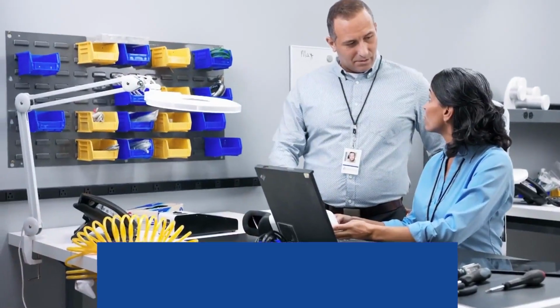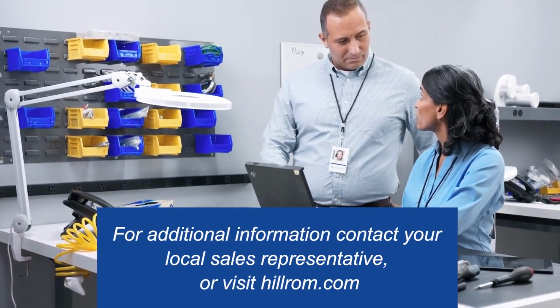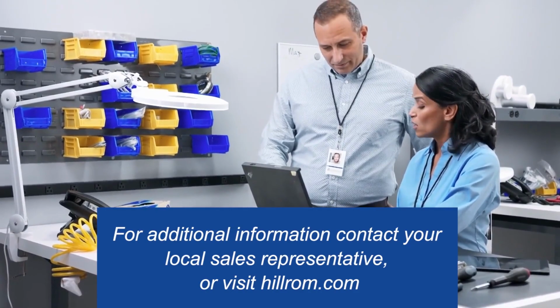This completes our overview of remote asset management, a better way to manage devices on your healthcare system network. For additional information on the platform, please contact your local sales representative.